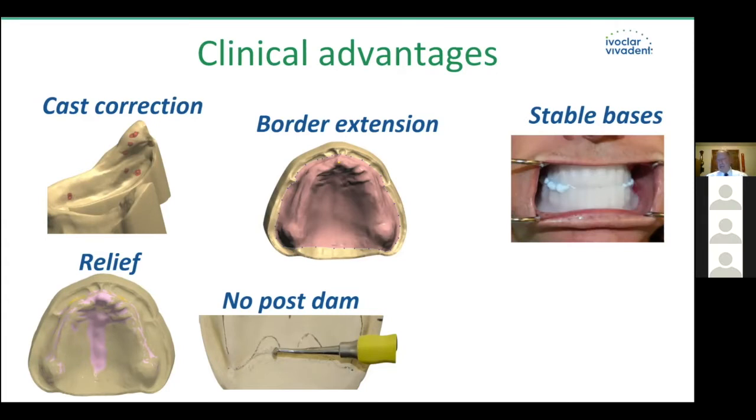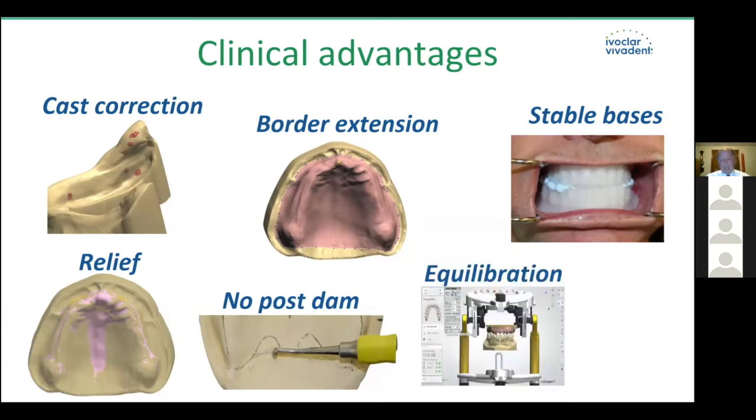Taking jaw records, as a clinician, is hard to do, and it's hard to do well, because most of the time we're dealing with bases that are rather unstable. Whereas with our milled, even printed bases for the interim procedures, you can pretty much guarantee they're going to be extremely more accurate than what we've been dealing with in our traditional denture bases. So your chances of getting an accurate jaw record are greatly enhanced.